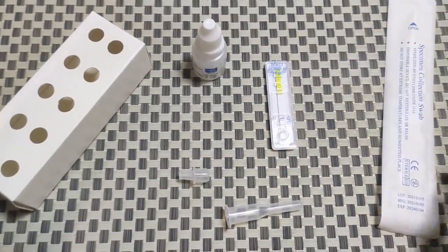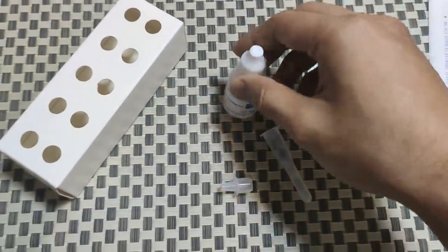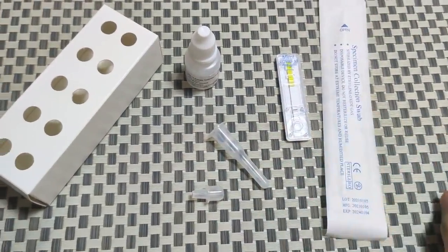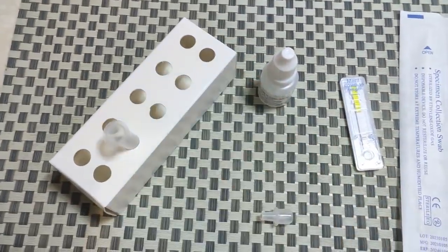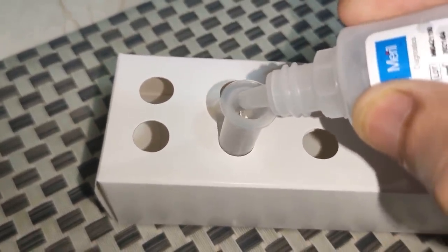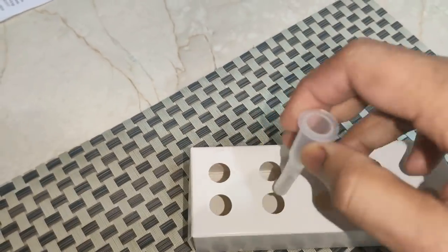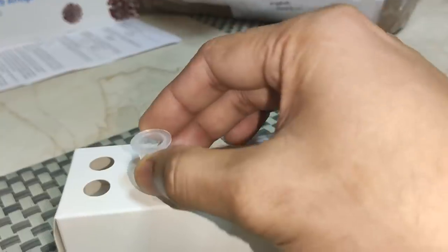To prepare the specimen collection tube, you simply need to take this extraction solution and put 12 to 14 drops into this Eppendorf. Make sure that the extraction tube is ready and properly placed in the tube holder. We've already put 12 drops in — it's done. You can clearly see this is how much solution you're going to get, and this much solution is necessary, otherwise it will not run properly.